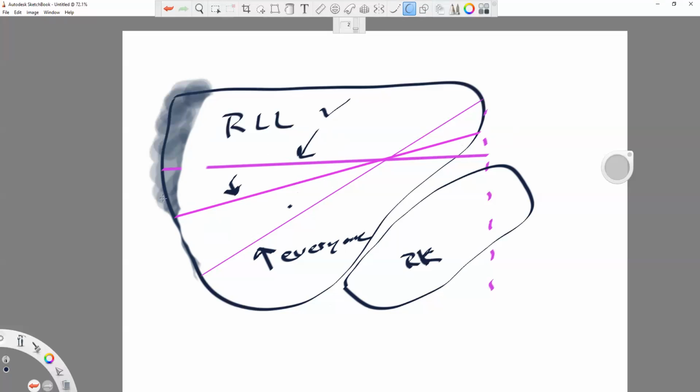I don't fully understand the anterior approach. I don't know how, on an adult who is difficult to scan, you possibly can get that image. So I'm not disagreeing with Southwest X-ray. I just simply don't understand how they could possibly do it correctly. I could see how they could do it incorrectly, and that's the scary part. Okay, I hope that wasn't confusing. So that's a liver measurement.